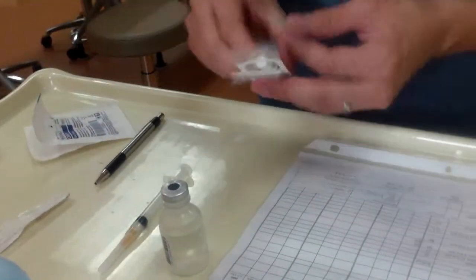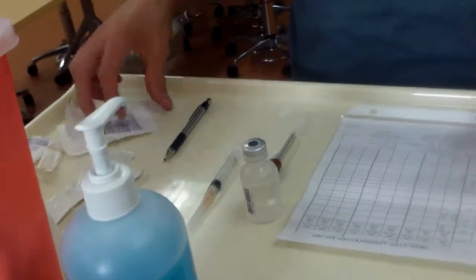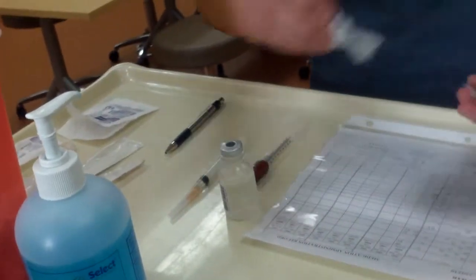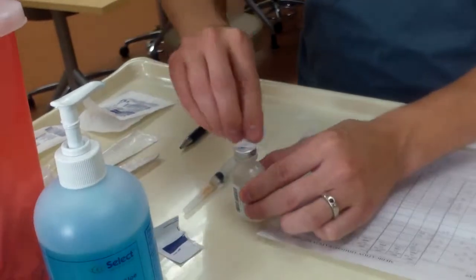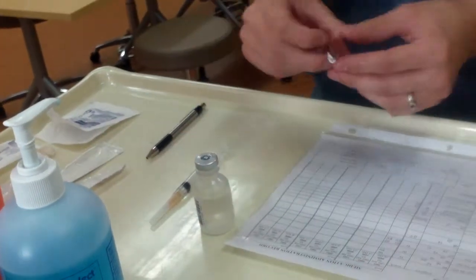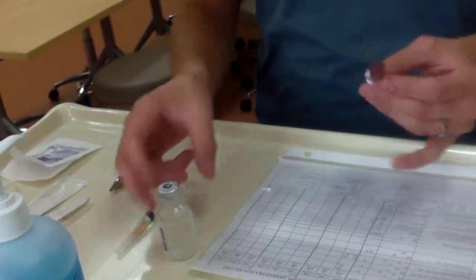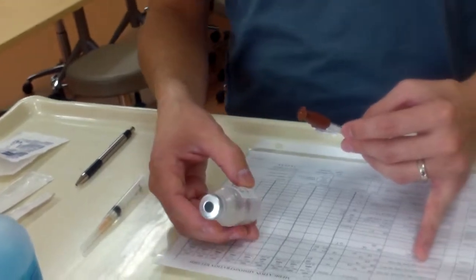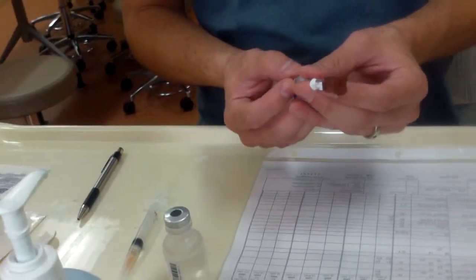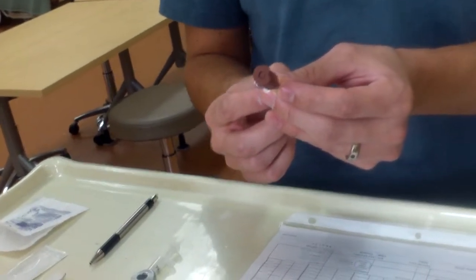So then I need to do that. I have my intradermal medication. Alright, there's my alcohol. Do that on the top. Good. And now this is my second check, so I did the second check in the 5 rights: time, route, dose, medication, and patient. I need 0.25 milliliters of this medication.